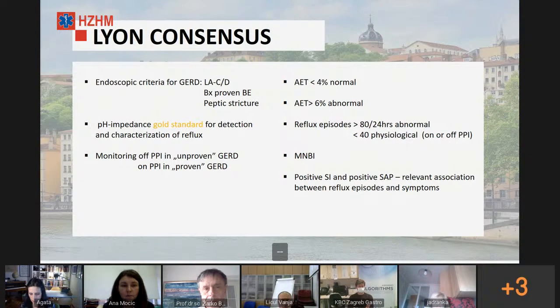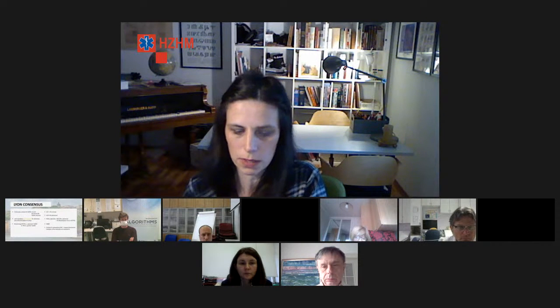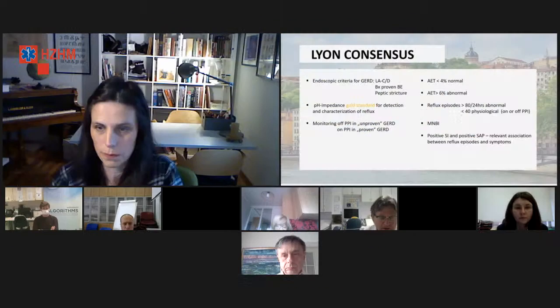Pa evo, pričali smo o kateterima, pa na koji način zapravo Sveti Duh isto pristupa postavljanju katetera, kad odlučiti se za samo pH senzore. Ono što je meni veliko pitanje, evo profesor Sifrim, a vidjela sam da to u Londonu rade sa kateterima koji imaju i želučani pH i pH jednjaka mjere i impedance. Mi imamo samo ovaj koji ima distalni senzor u jednjaku. Pa zapravo ne znam koliko je, vjerojatno je velika prednost tog katetera, ali ne znam koliko po cjenovnom rangu. Što vi mislite o tom kateteru koji ima i želučani senzor? Bi li ga se isplatilo postavljati podredovno?